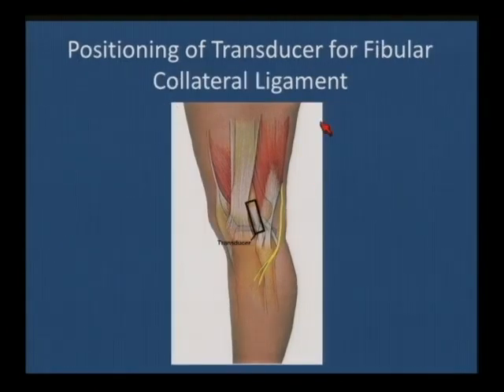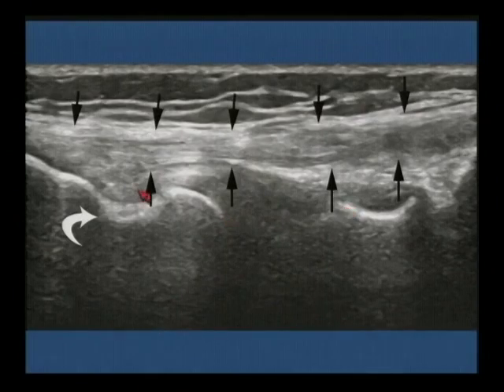And then there's the fibular collateral ligament proper, the cord-like fibular collateral ligament, which is going to arise just above the notch for the popliteus and run backwards and downwards slightly to insert with the biceps on the lateral aspect of the fibular head. And the fibular collateral ligament can actually be quite tricky, can be difficult sometimes to visualize.